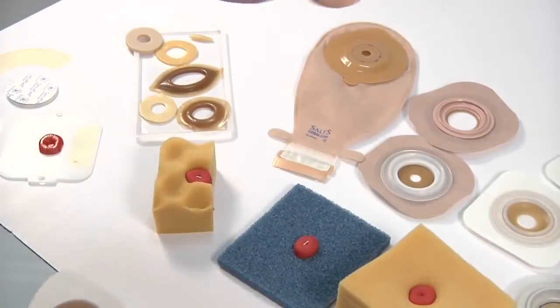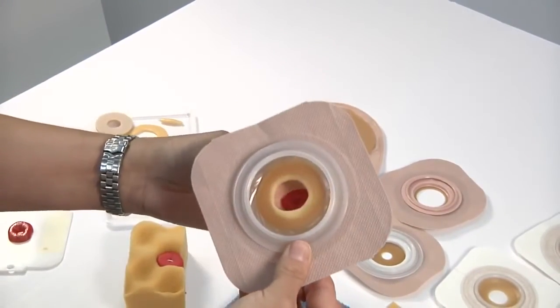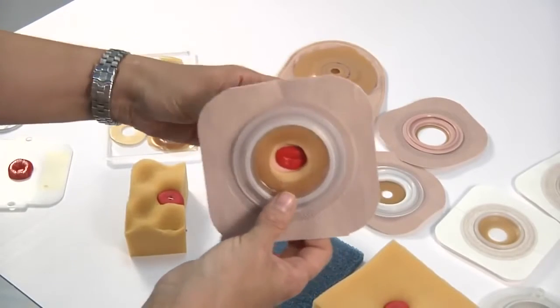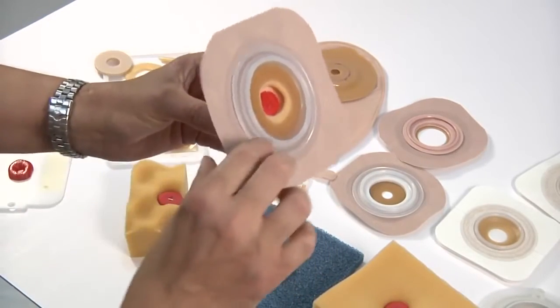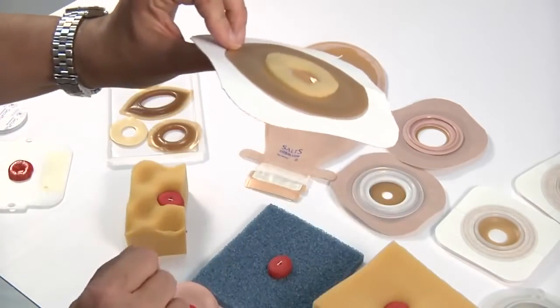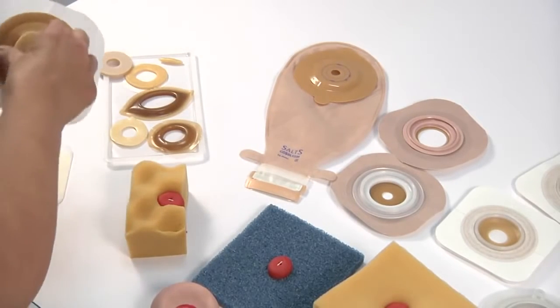So if you had somebody that's got a small little gully like that, you would see whether or not that barrier on the back of that flange is enough to fill that in. And that's probably not enough of a filler. You can actually see a gap there. So you would probably be looking for something that's got a little bit more convexity. But that's a low level. That's an extremely low level of convexity that you can make yourself.